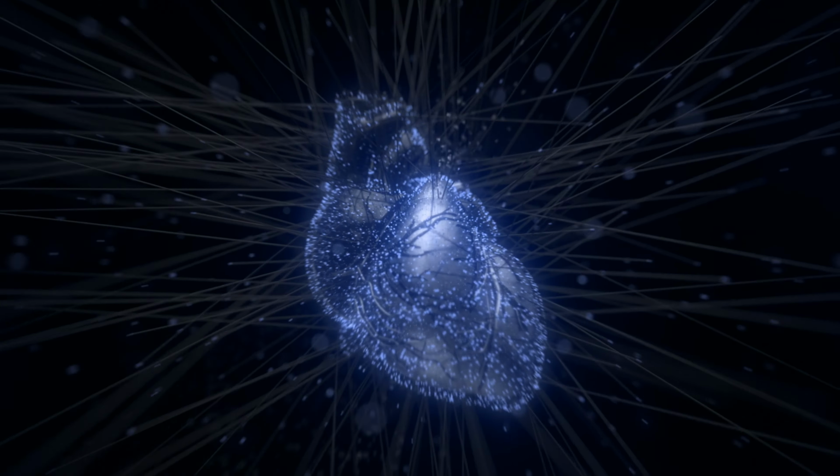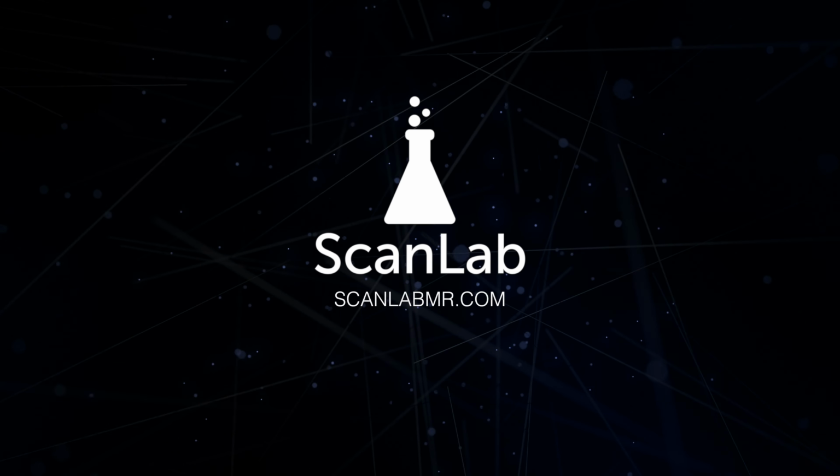So I think it's going to cause a big paradigm shift when it comes to protocol management, to be able to make quick decisions when patients really call for it, really being able to understand how these parameters impact our desired patient outcomes. I think this is a big step forward for us in ScanLab and for MRI as a whole. So I hope you agree, and thank you for your interest in what it is we're doing in ScanLab.